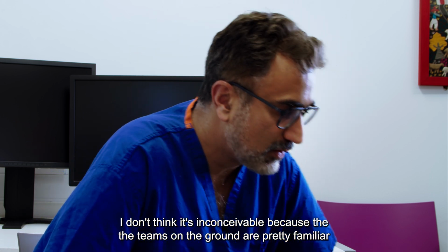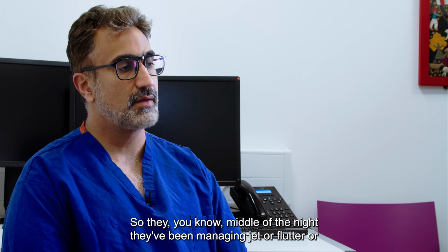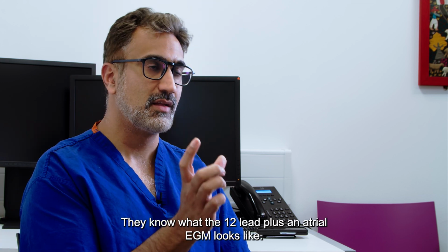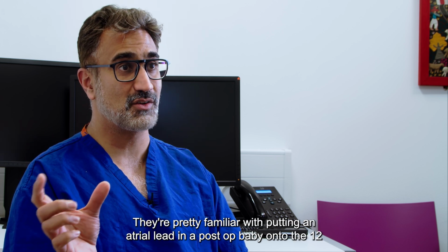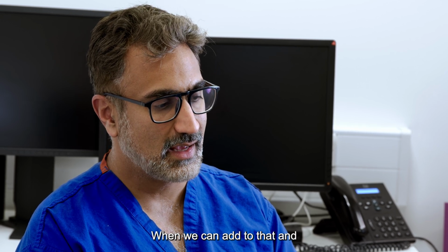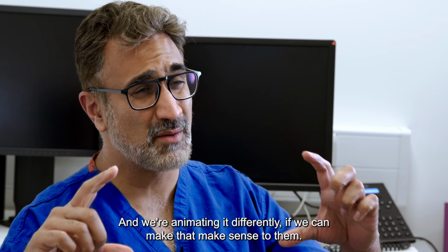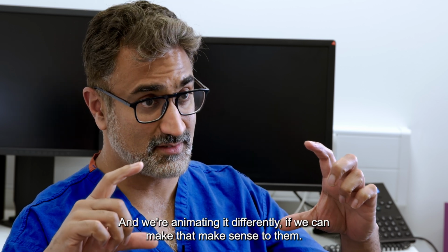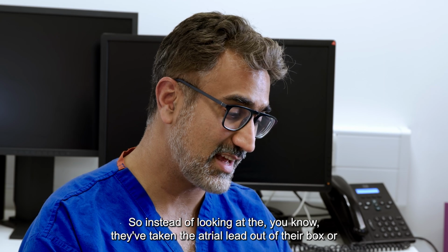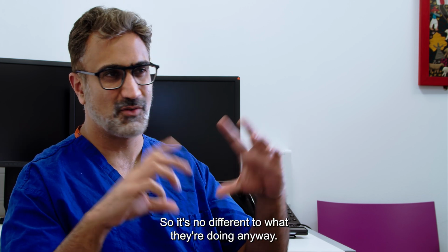Yeah, I don't think it's inconceivable because the teams on the ground are pretty familiar with standard arrhythmia. In the middle of the night, they've been managing JET or flutter or reentrant tachycardia for years. So they know what the 12 lead looks like. They know what the 12 lead plus an atrial EGM looks like. They're pretty familiar with putting an atrial lead in a post-op baby onto the 12 lead, so they know the relationship of A and V. What we can add to that, and we're not changing much, we're just changing that paper strip to a screen, and we're animating it differently. If we can make that make sense to them, so instead of taking the atrial lead out of the box or the wires and plugging it in, they're just reimagining the same thing on a different platform. So it's no different to what they're doing anyway.